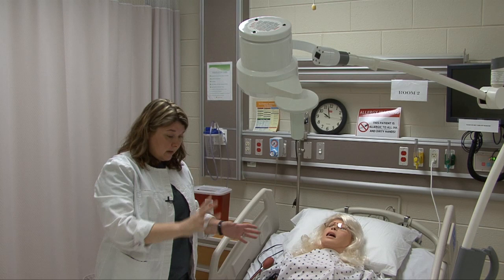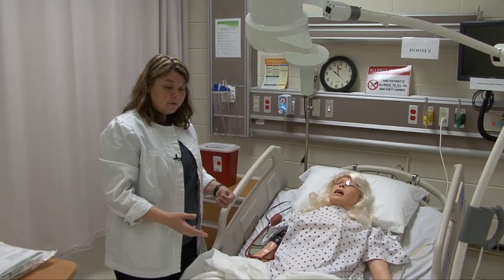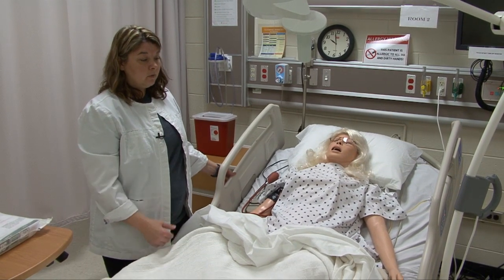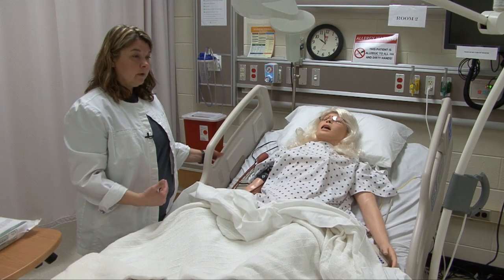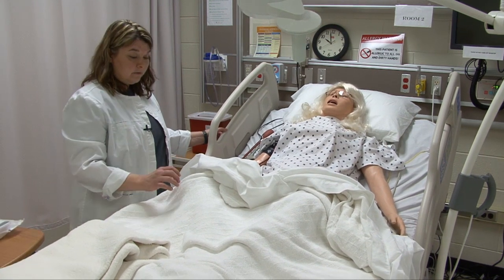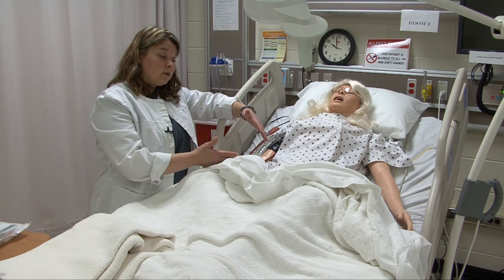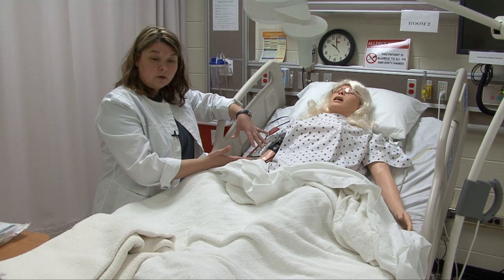Roll up the bed — make sure you get it up high enough. Most folks get it up to elbow level. If you're right-handed, stand on the right side of the bed; if left-handed, stand on the left side. Make sure your bed is high enough so that when you're doing the procedure down here, you're not having to bend over with your back, and it makes it easier for you to visualize your structures.